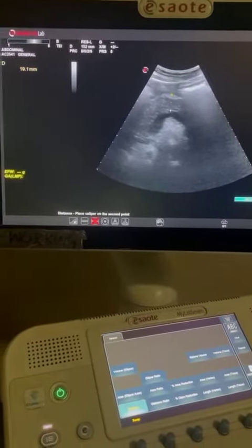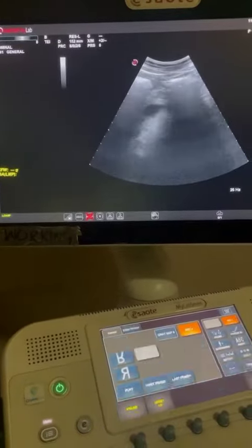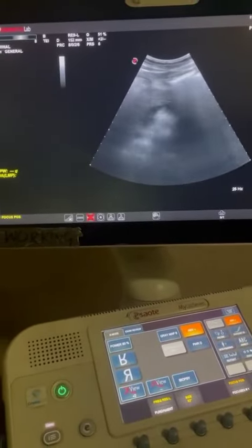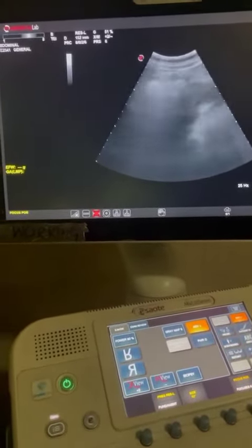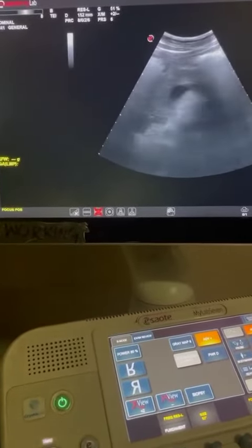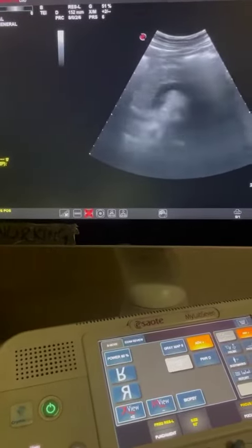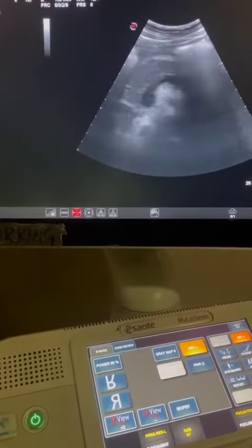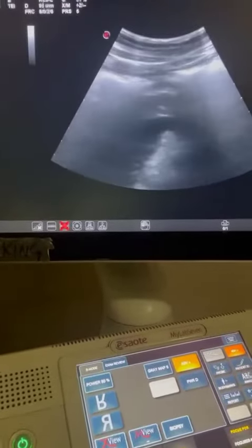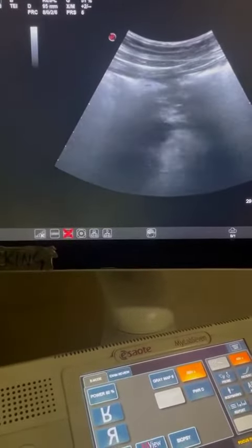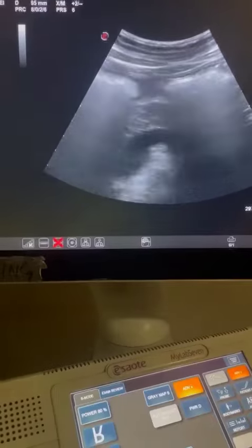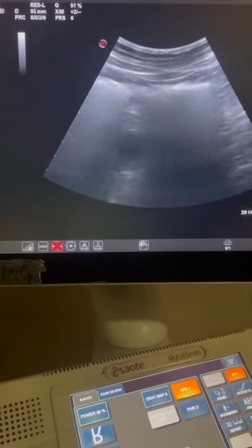I am measuring the size of the pancreatic body, which measures about two centimeters. Now we will measure the pancreatic head and the pancreatic duct passing through it. You can see the pancreas is swollen and edematous, with mild peripancreatic free fluid seen along the pancreas.